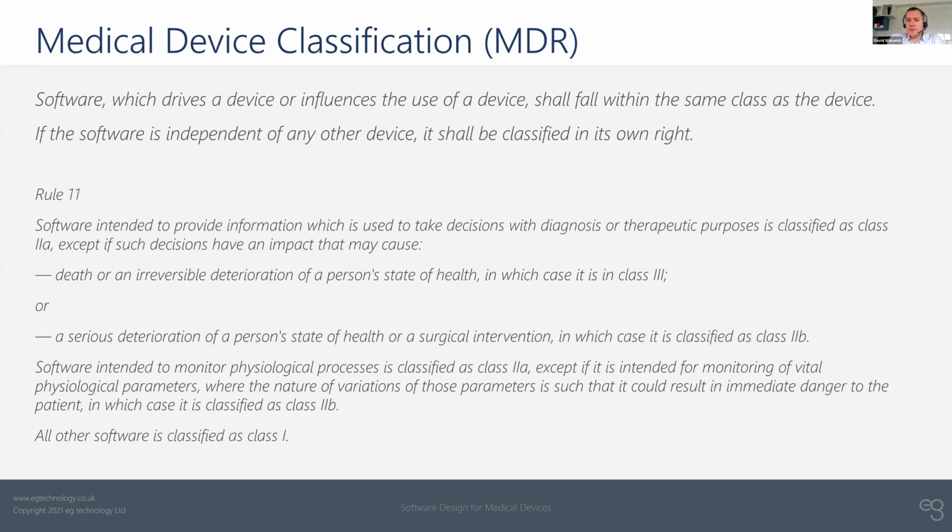Perhaps can you tell us a little bit more about the specific application? Yeah, can you hear me? Yep. Again, I don't want to bore everyone, but the specific application that we are developing analyzes changes in physiological markers, which we basically measure using any Apple Watch or Fitbit. And then we provide, hopefully, a decision support analysis on the effectiveness of the medical treatment in the ADHD area, attention deficit hyperactive disorder.